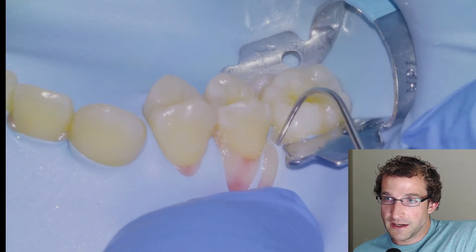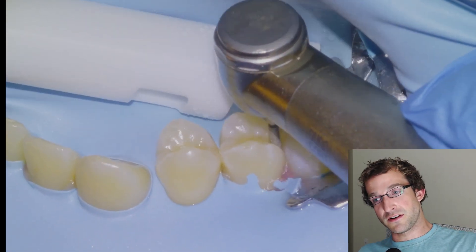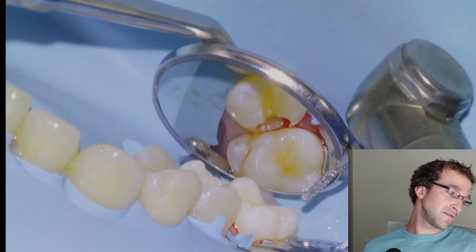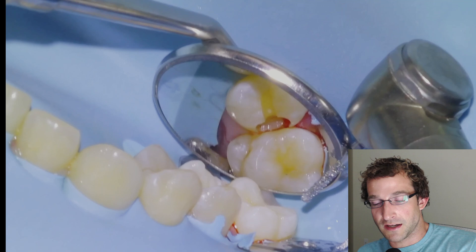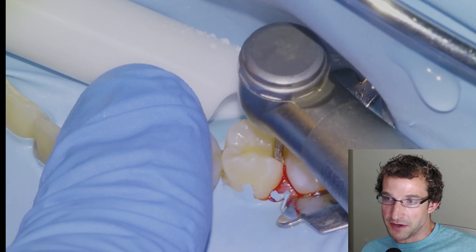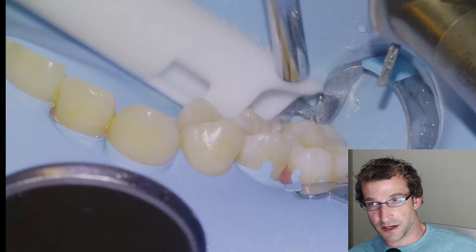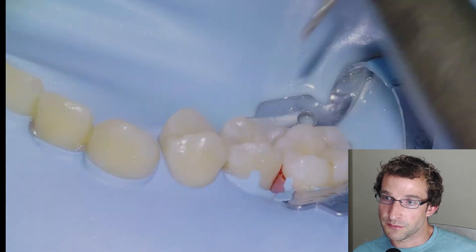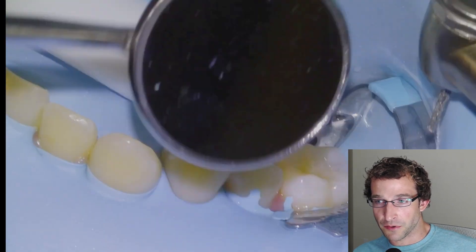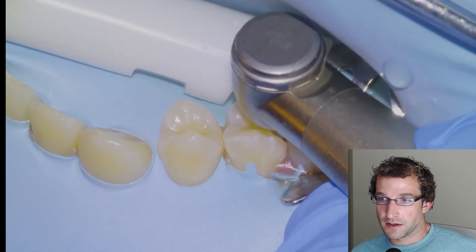I like to do an occlusal dovetail for all my Class IIs, and then we'll start doing a slot prep and fish the rest of that septum out. For a situation like this, if I can get direct vision I'll take it — so I'll have the patient look all the way to the left and move to nine or ten o'clock to do the interproximal preparation. Then I'll go back and forth with the mirror checking where the tooth needs more reduction, checking the lingual, doing more lingual reduction until we're satisfied with the interproximal preparation.